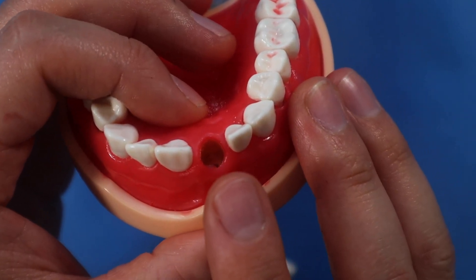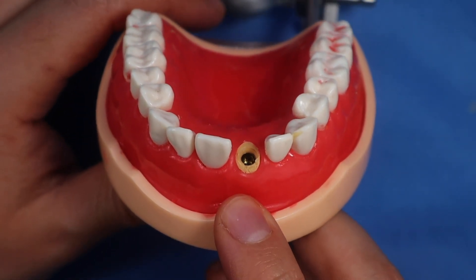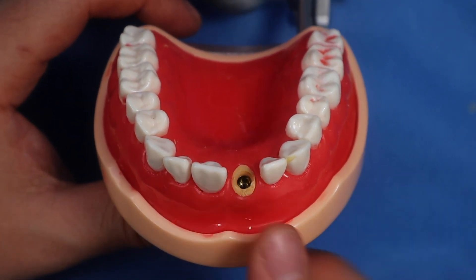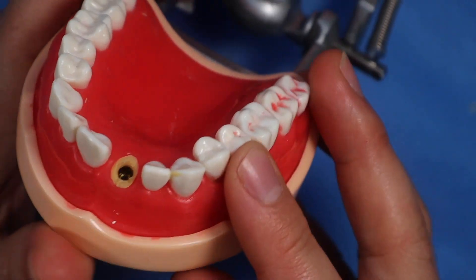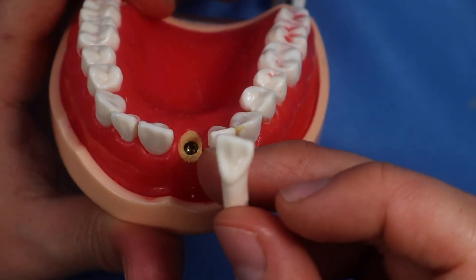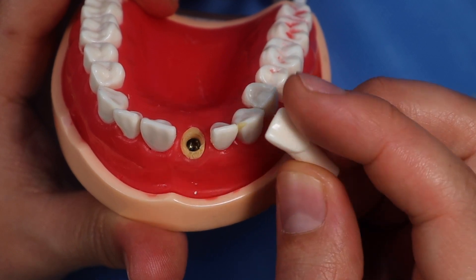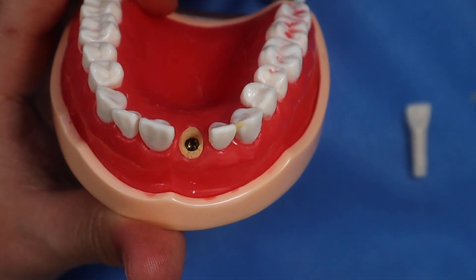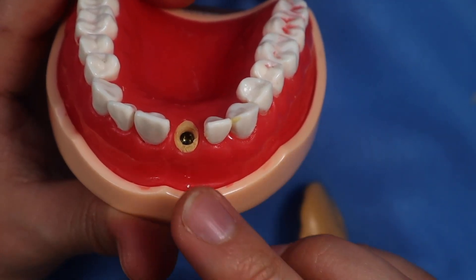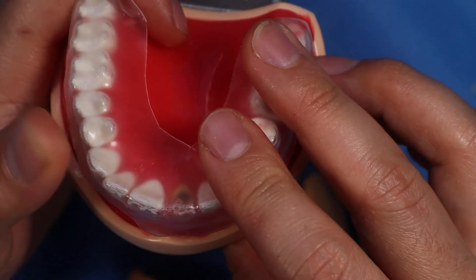Now your implant is placed right here, and you have all the ingredients you need for immediate temporization. You have your implant nicely placed, making sure the access is not coming out of the facial aspect of the teeth. You also have an intact tooth — at least the coronal aspect isn't broken down. You have the putty, you have the tooth, and if you wanted to do it the old-school way you could use this vacuform splint.